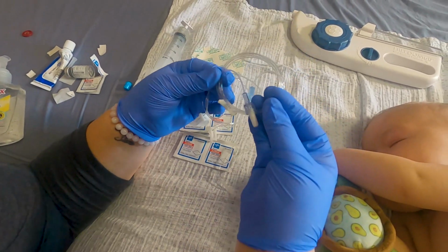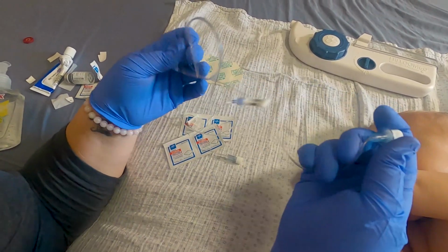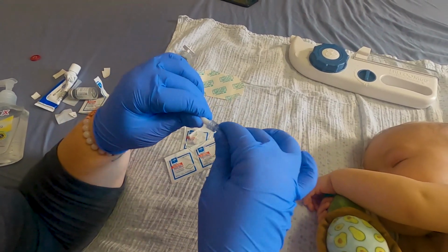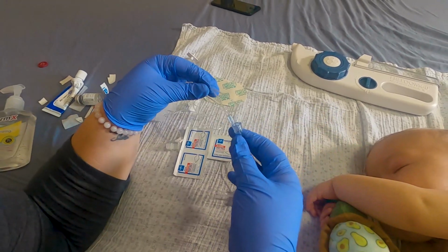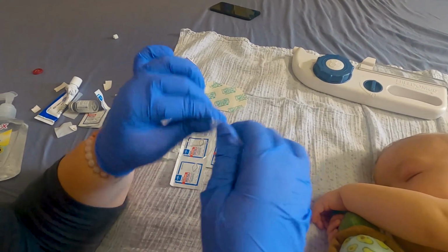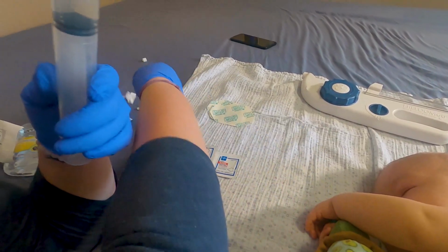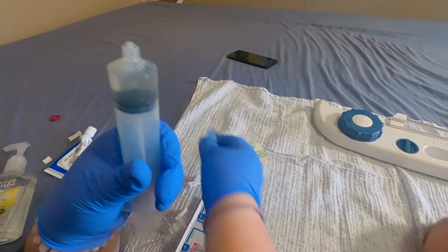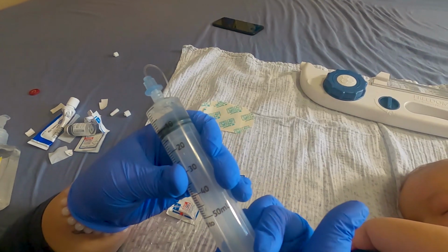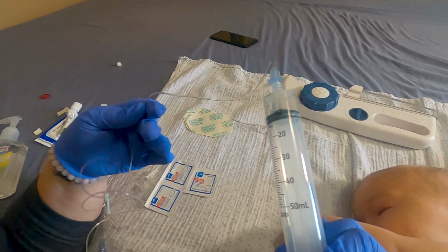Okay, and this is the second part. That part. So we take our tubing ends and screw them together. Then we're going to take our spike off, and we're going to connect them and then start pushing it through. It's actually really hard to get this pushed through because the tubing is so small. I can do it.